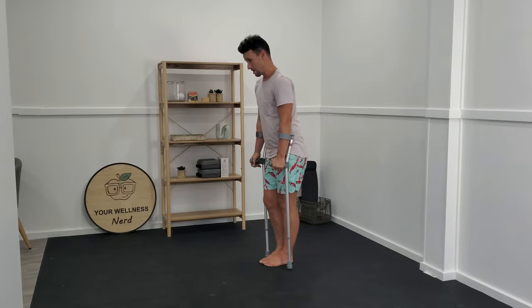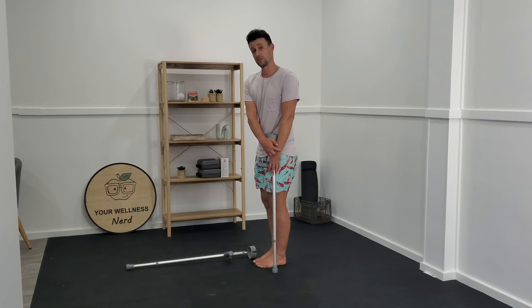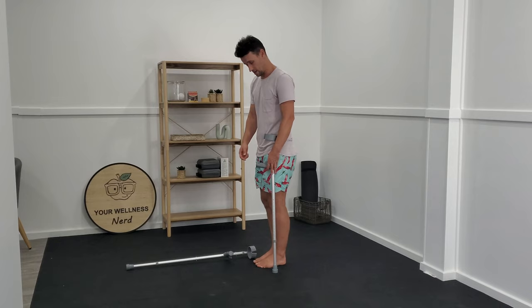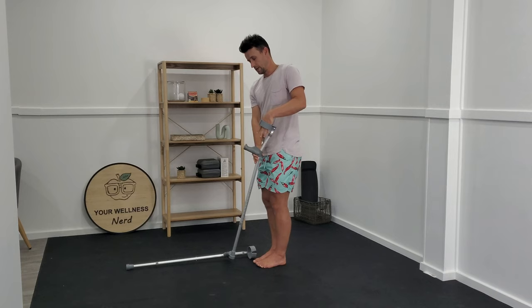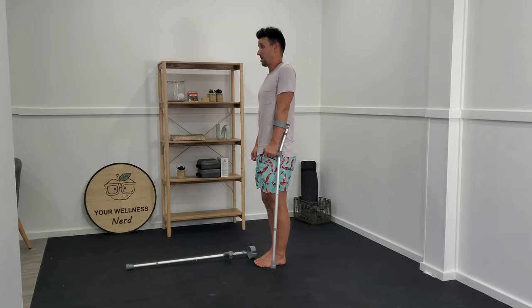A great reference point here is that when you stand up comfortably tall and have your crutch just next to you, ideally the handle should line up pretty closely with the bump at the side of your wrist. As you can see, there's a decent gap between those two spots for me. So if I bring this up two levels just to see what that feels like and place my hand back in there again, straight away I feel comfortably tall. I don't feel like I'm dropping my shoulders at all.